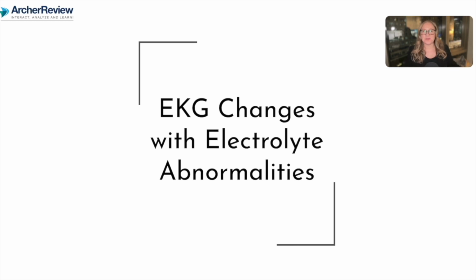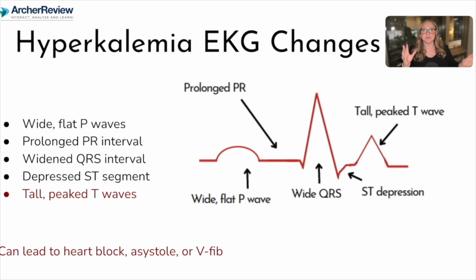I'm going to start off with potassium. That's certainly the most infamous for changing the EKG that you see. Remember, potassium is an important component of depolarization, actually sending that electrical activity through the heart. So high or low levels of potassium, no good for our EKG. Let's talk first about what high potassium does, hyperkalemia.